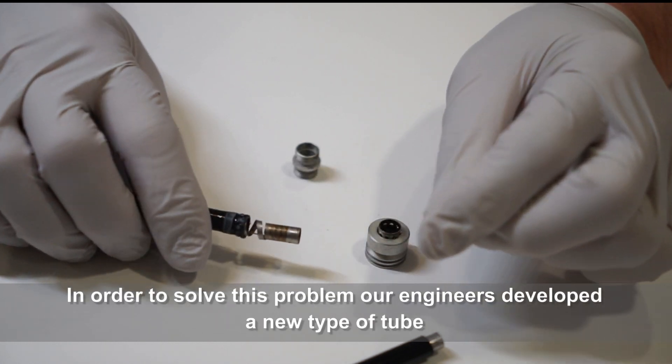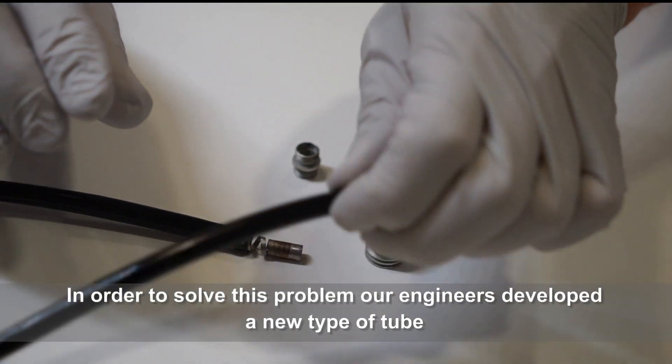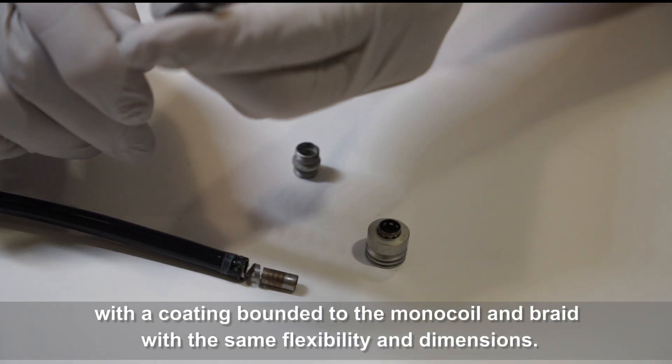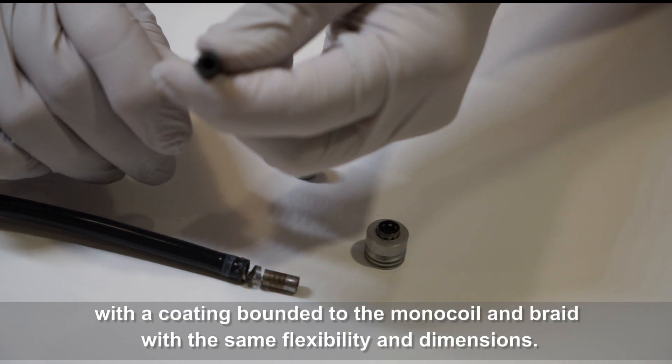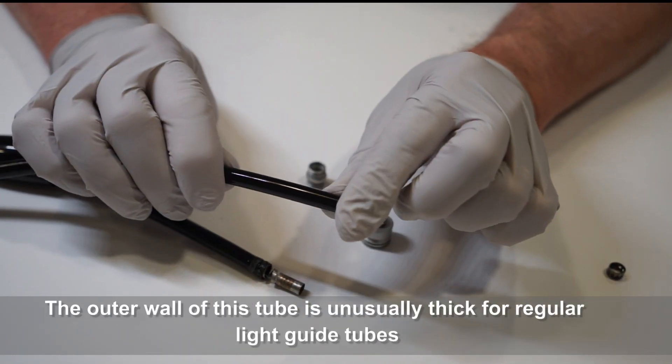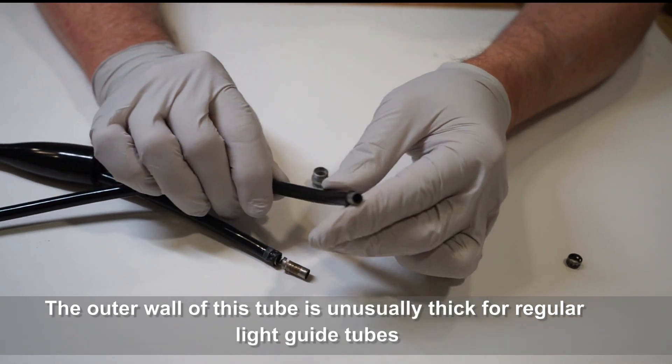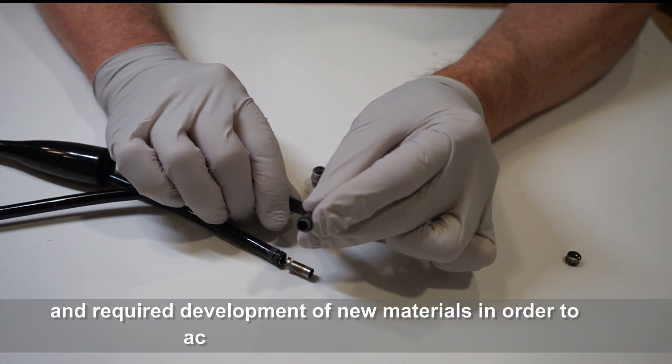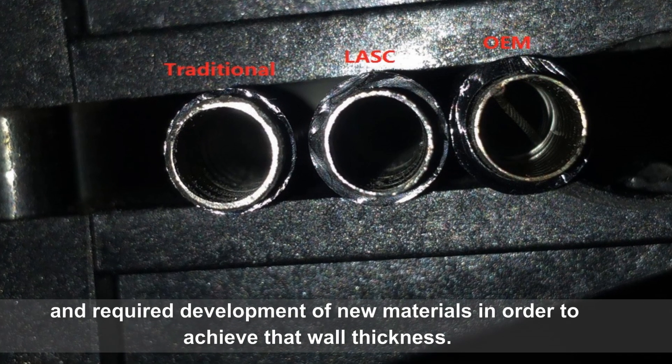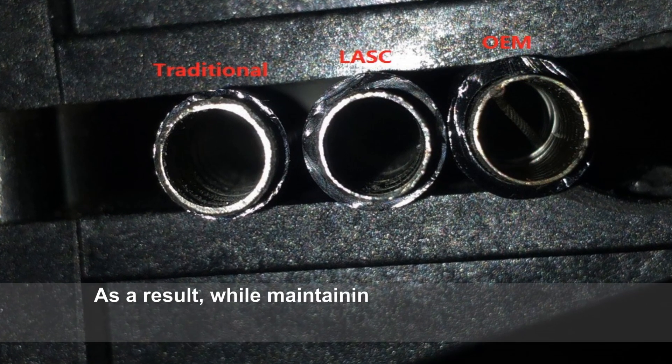In order to solve this problem, our engineers developed a new type of tube with a coating bonded to the monocoil and braid with the same flexibility and dimensions. The outer wall of this tube is unusually thick for regular light guide tubes and required the development of new materials in order to achieve that wall thickness.